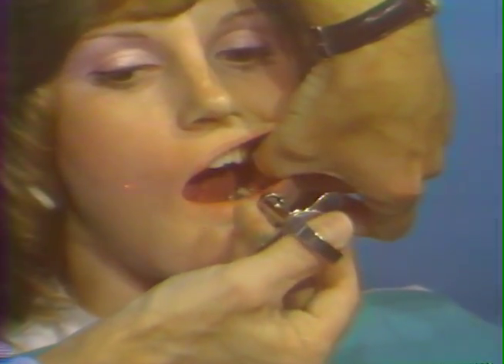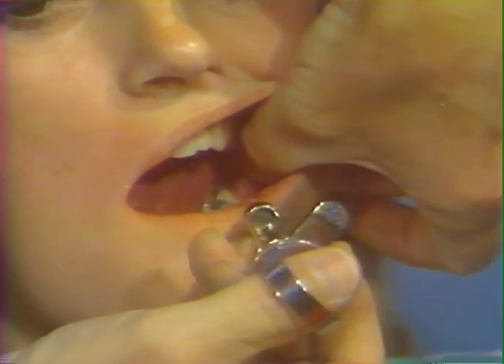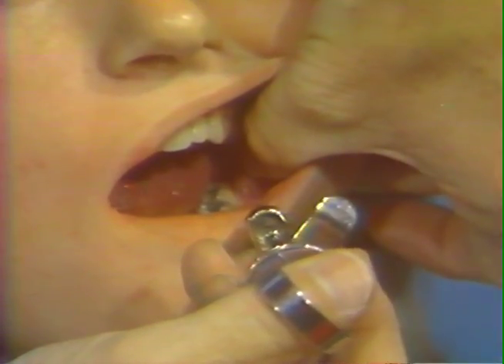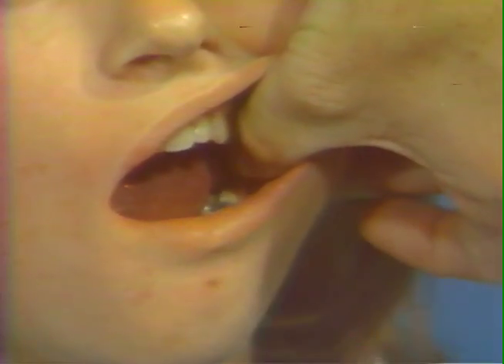For the long buccal nerve of the left side, now open real wide. Once again, the thumb is used as the retracting finger. The needle is placed backwards in line with the plane of the teeth to the coronoid notch as the long buccal nerve crosses this area, and removed.